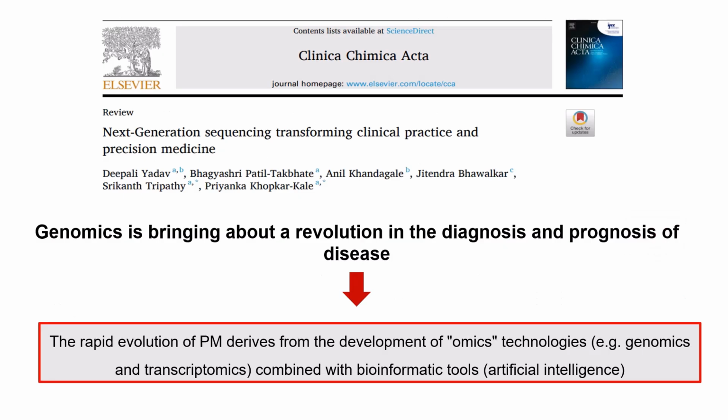The rapid evolution of precision medicine has been driven significantly by the progress in omics technologies, such as next-generation sequencing and third-generation sequencing approaches. NGS allows for rapid and cost-effective analysis of DNA, RNA, and epigenetic modification at high resolution. This detailed molecular profiling helps in identifying specific genetic alterations, biomarkers, and molecular signatures that are associated with disease susceptibility, progression, and response to treatment.